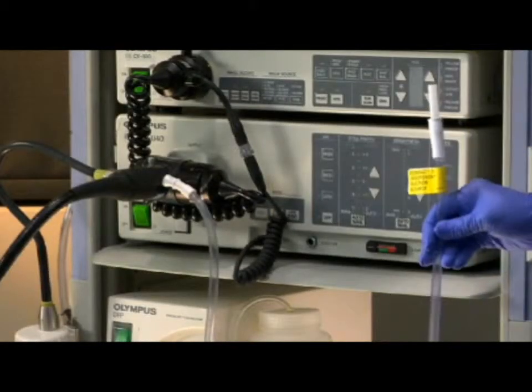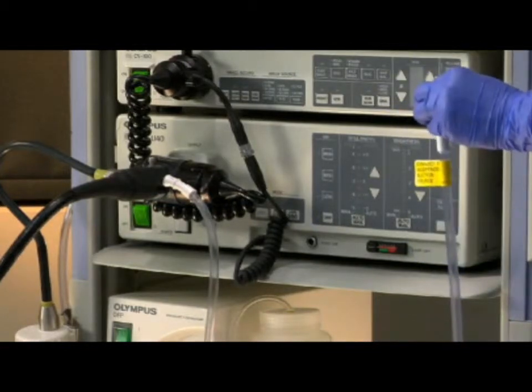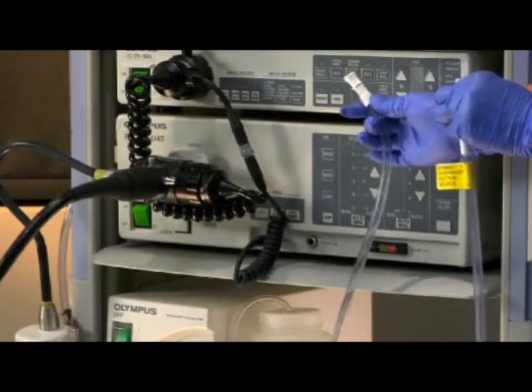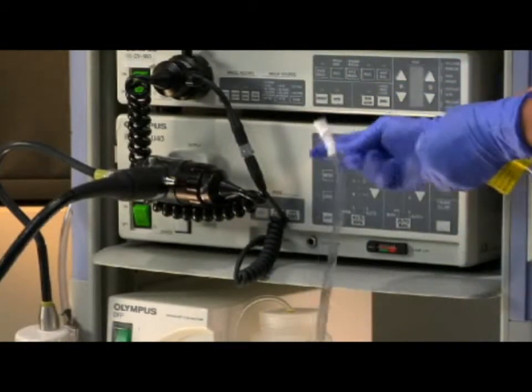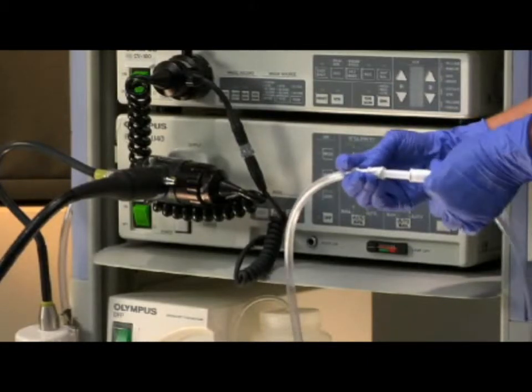Find the yellow tag on the BioVac device's suction tubing. Remove the existing length of suction tubing from the endoscope suction barb. Connect the existing length of suction tubing from the endoscope to the plastic coupler on the BioVac device.